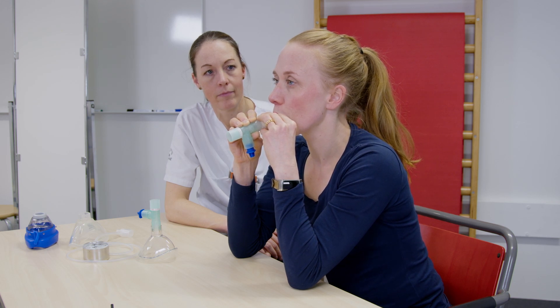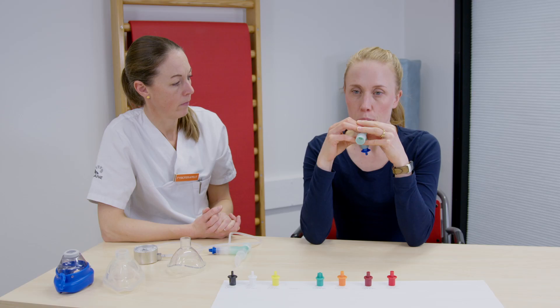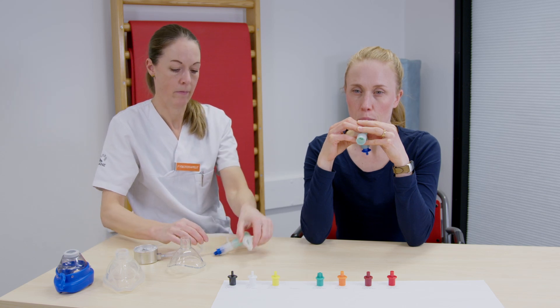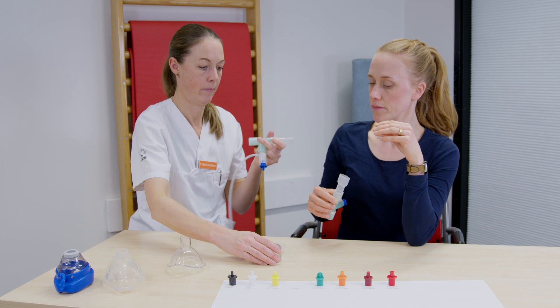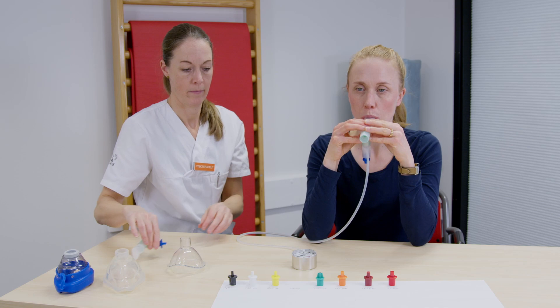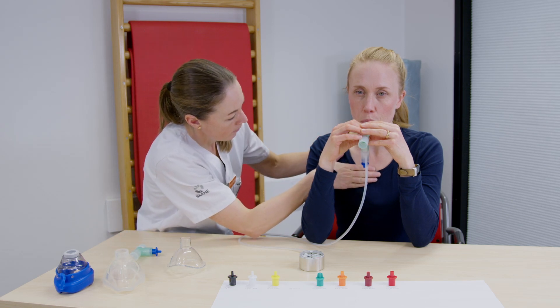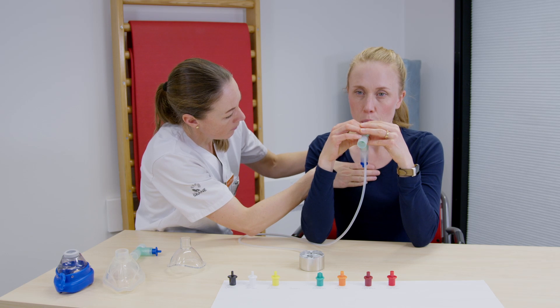Låt patienten andas minst tio andetag i följd. Använd gärna manometern vid utprovning. Efter några andetag bör det mittexpiratoriska trycket ligga mellan 10 och 20 cm vatten. Försäkra dig också om att det sker en rörelse och successiv vidgning av bröstkorgen under peppbehandlingen, genom att titta på patientens andningsmönster.